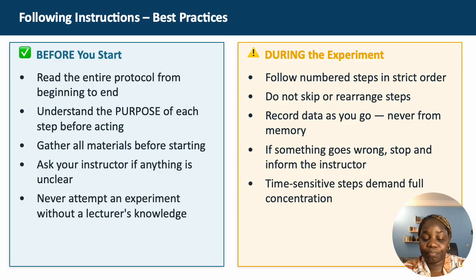And also be time sensitive, as the steps demand full concentration. You should be aware of the approximate amount of time one step can take. If you have something to prepare in between 2 steps, or while waiting for one step to finish, you should be aware of the time of each step before, and this is during the experiment.